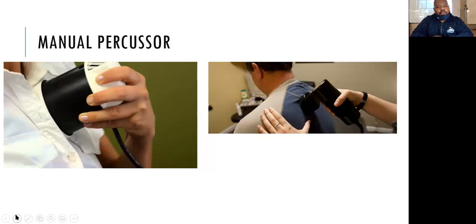Now, this is the manual percussor here. This one looks like it plugs into electricity, but this part here will go up and down. This white piece here is like a drum that percusses. Then you have this vibrator over here that vibrates really strong to help move those secretions. So these will be your manual percussor or vibrators.